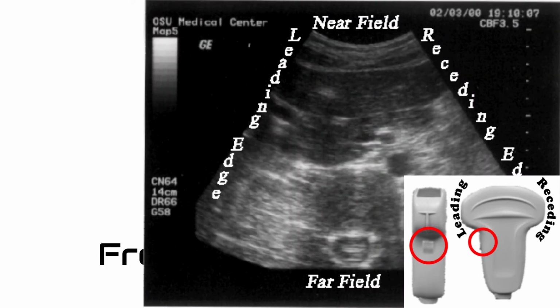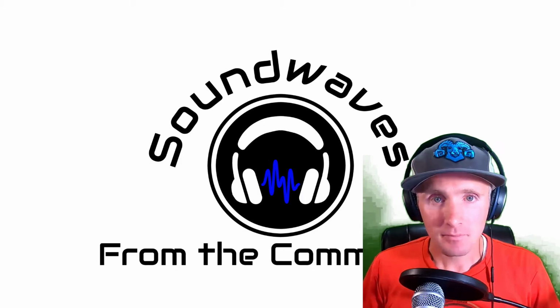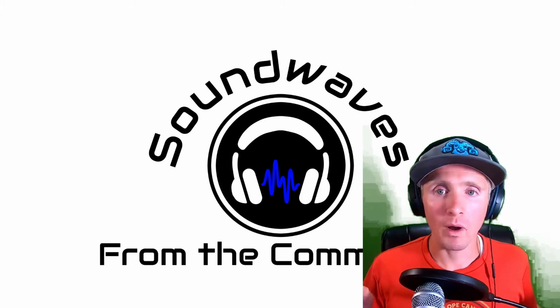The leading edge of the screen should be on the left, with the indicator on the left of the screen. The leading edge of the probe should be pointing to your left, not the patient's left or the patient's right, always to your left.